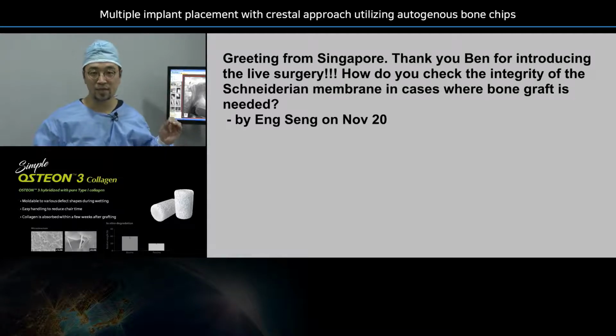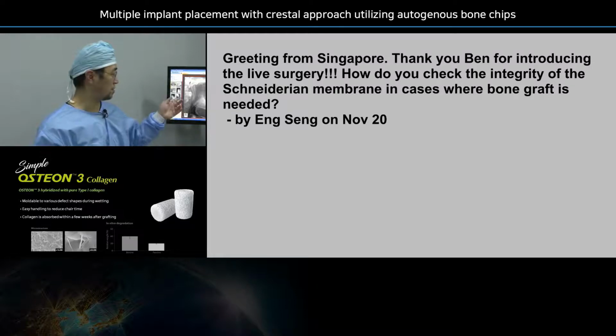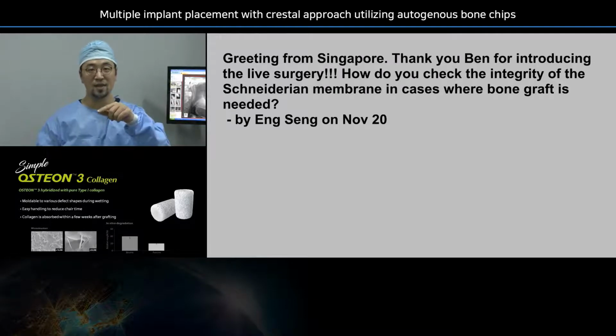Today, I have seen the CBCT and there was a thickening of the membrane. So which means that the more chance maybe I will have if I do the aggressive crestal approaches, but due to this thickness and a little bit of the hardening of the membrane, it was easy for me because when I touched the membrane, it was quite intact and it did not break, as you can see from the x-ray. So the bone is grafted nicely in a dome shaped. So all of the information about the Schneiderian membrane integrity comes from the cone beam CT.